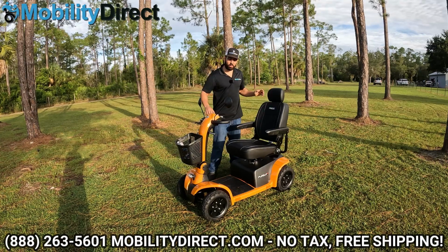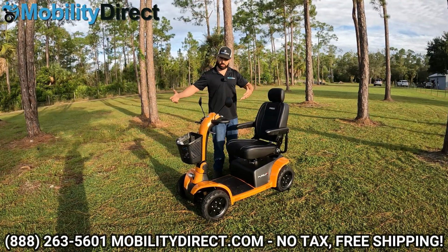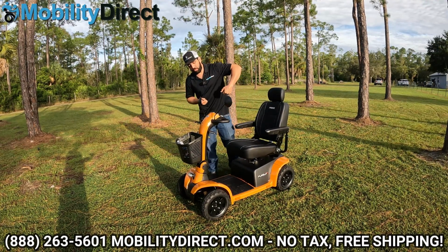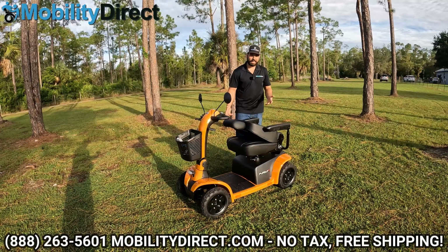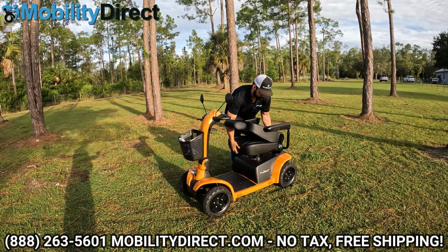Now, the other thing is, if you have a van or an SUV and you have enough strength or 2 people to help you lift the front end up onto the bumper and then pull the back end up and wheel it in, there's something you could do. So what you would probably want to do is first remove the seat and then probably remove the batteries if you're going to do that to lighten up the load.